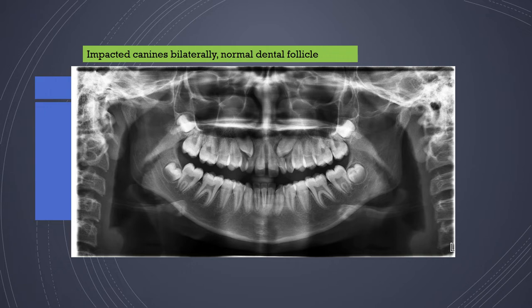Impacted canines, for example, are seen here bilaterally with a normal dental follicle. The dental follicle is the space around an unerupted tooth and should not be greater than 5 mm. If it is greater than 5 mm, it may indicate a cyst — most likely a dentigerous cyst.